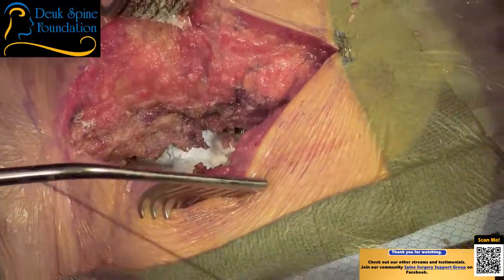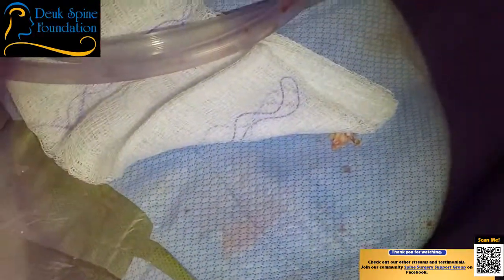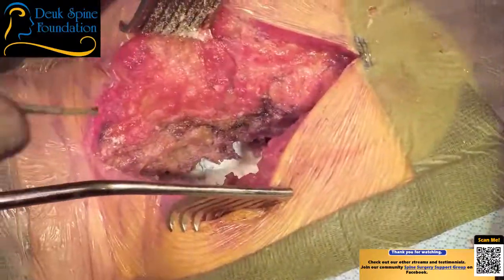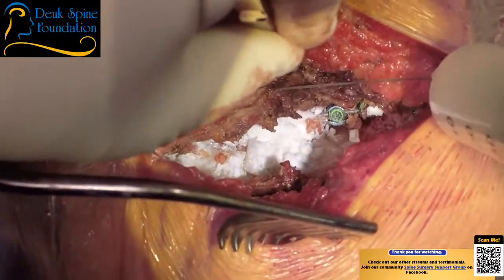And like I said, in the lumbar, I need a pickup. Yes, with teeth. We'll do a full gram for a one level lumbar, and then for a two or three level lumbar fusion, we'll do 2 grams.